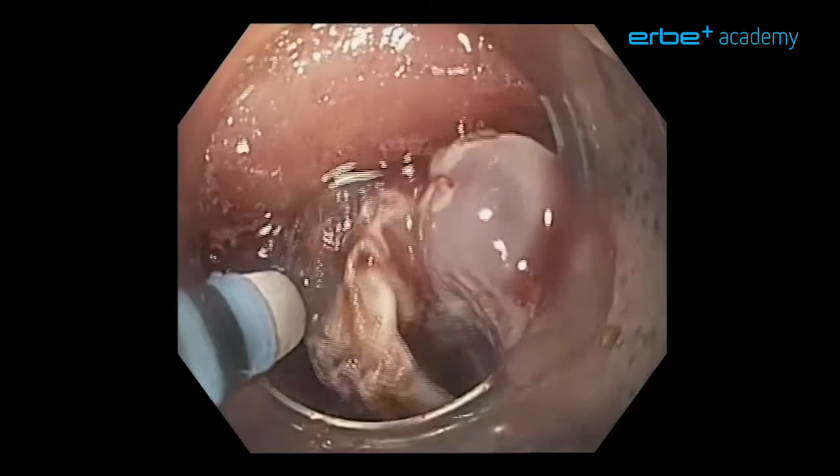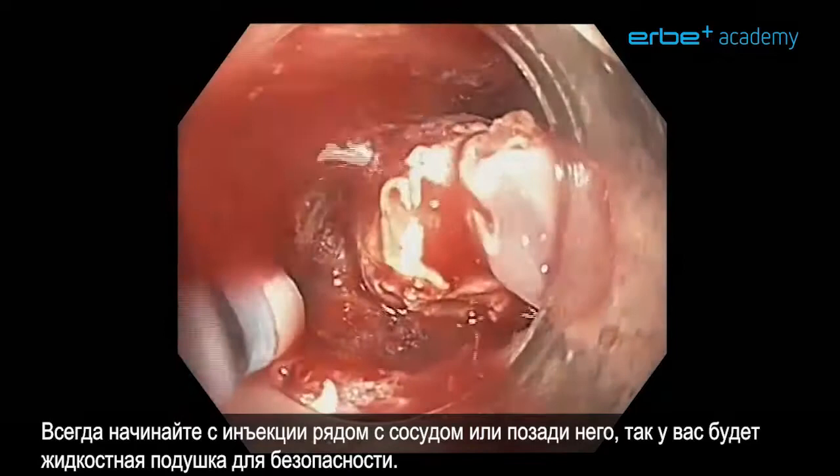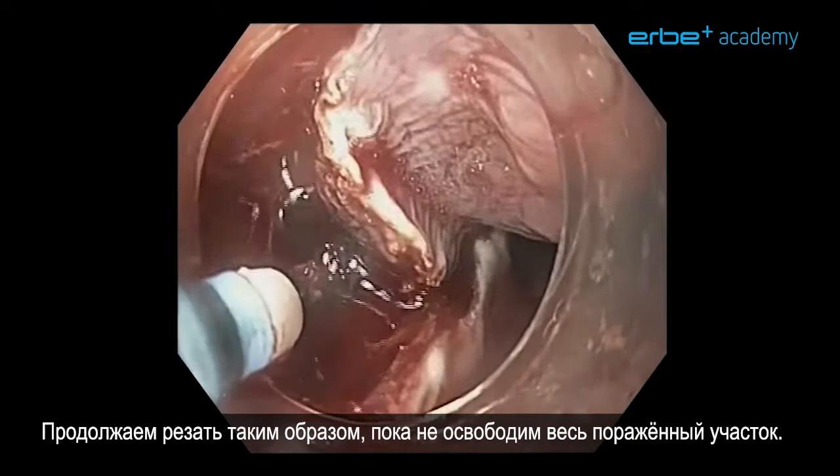You notice some bleeding which is a little bit more than usual but nothing we cannot handle. Most of the bleedings can be treated using the same hybrid knife. Always start with an injection next to or behind the vessel so you have a fluid cushion for safety — it is the same as injection therapy in ulcer bleeds. You compress the vessel a little bit and then you can safely treat it. We continue cutting until the whole lesion is free.